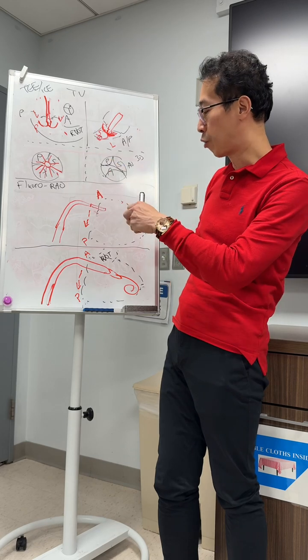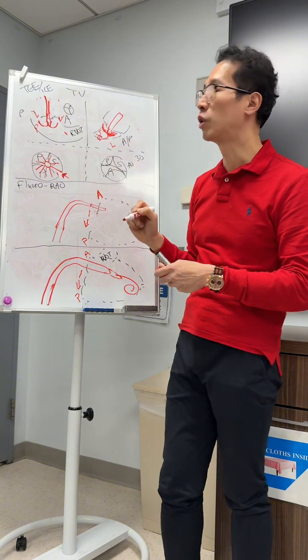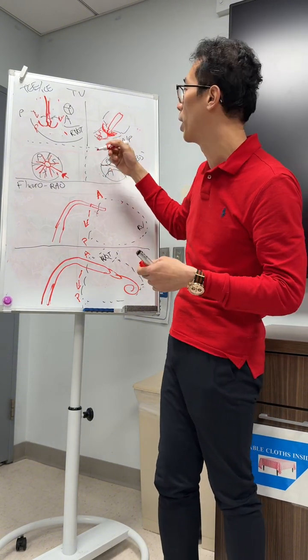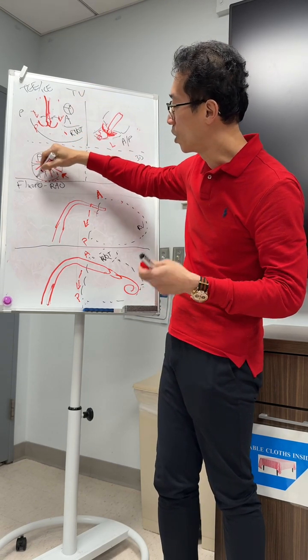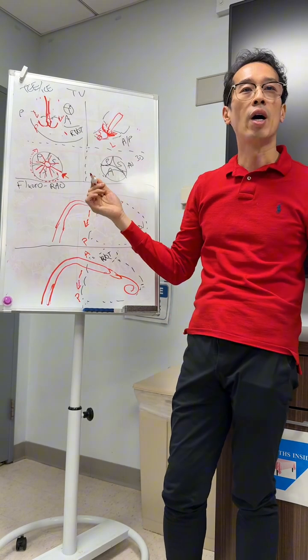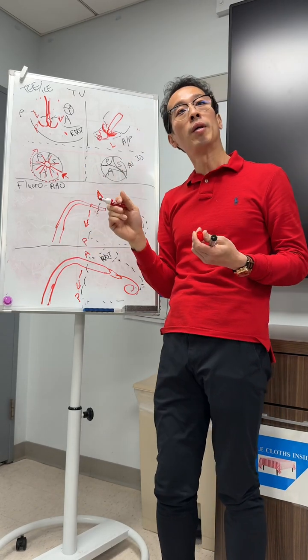So if we start here, we need to say we're starting at either 4 o'clock, whatever, pick whatever reference you want to baseline you start. And you need to look here to see. Then you need to systematically go, counterclockwise or clockwise, it doesn't matter. You just have to pick one way so that every time you do it the same way, you don't get confused.